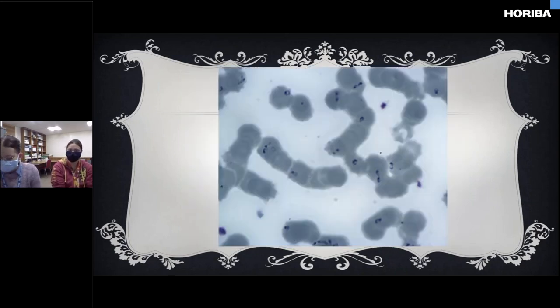So we looked at this film, and there are definitely alarm bells ringing now. It doesn't look pleasant at all. There's a lot going on. You can see there are some red cell inclusions. The circles aren't meant to be there. And obviously, this was my 9th on-call session. I had no idea what was going on.